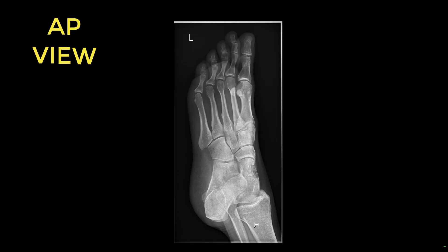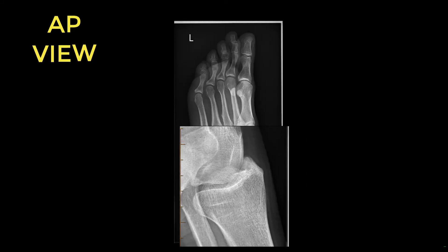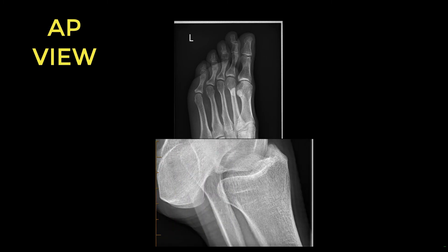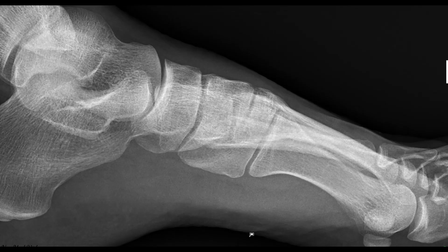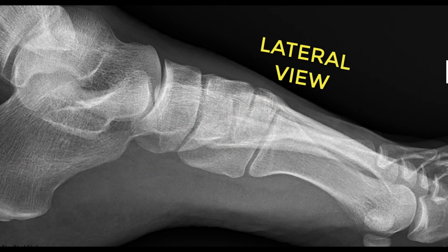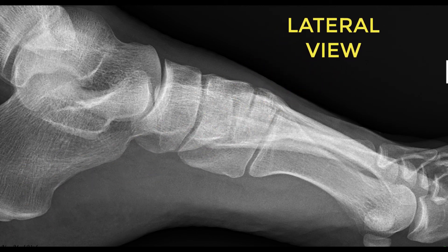Just proximal to the ankle joint, you have the leg bones: the tibia as the bigger bone and the fibula as the smaller bone. Now the other view to know is the lateral view.